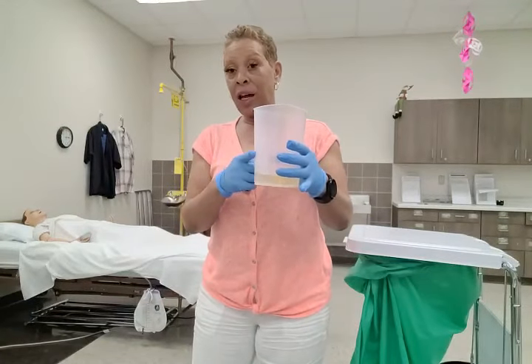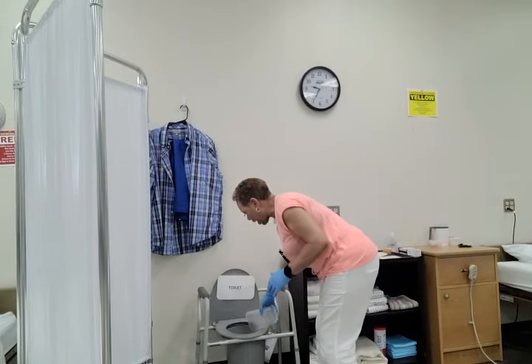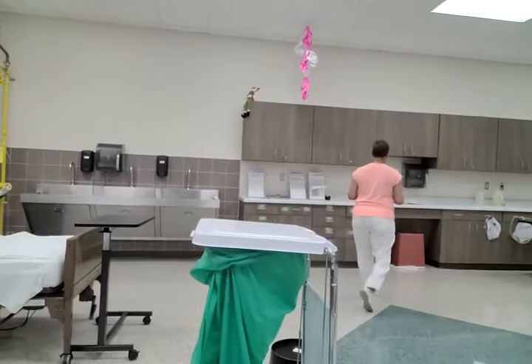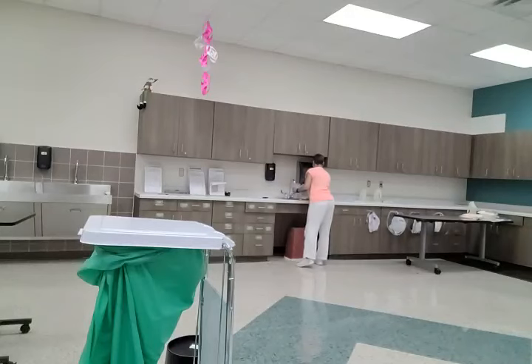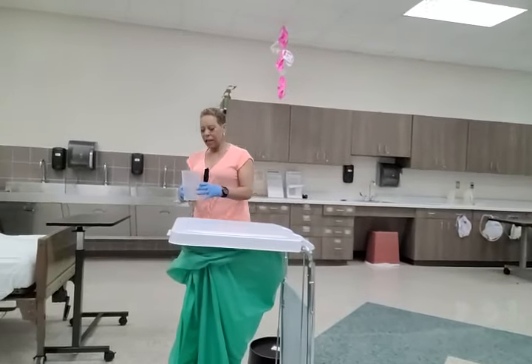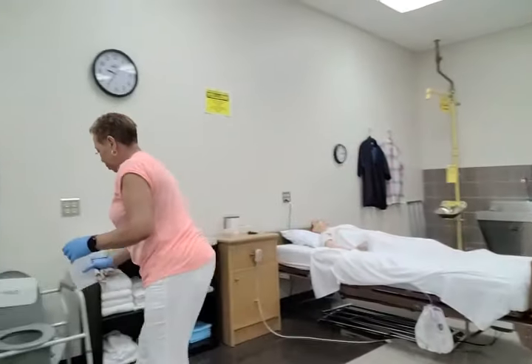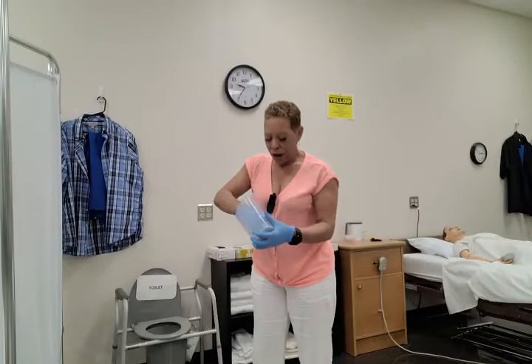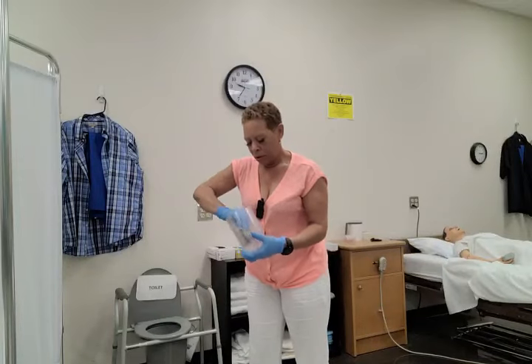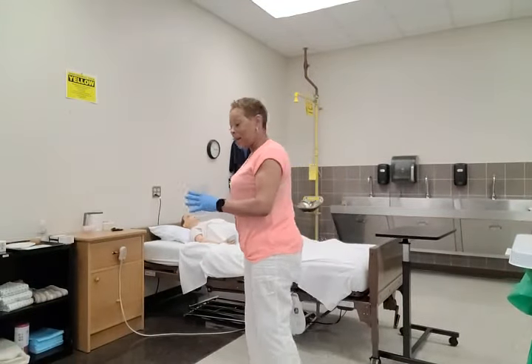I'm going to dispose of the clean barrier into the waste bin. Then I'm going to empty the contents of the measuring container into the bedside commode or toilet, making sure it does not splash. Now I'm going to rinse the measuring container and also dispose of the rinse into the bedside commode or toilet, making sure it does not splash. Then I will dry the graduate and replace it back in the storage area.